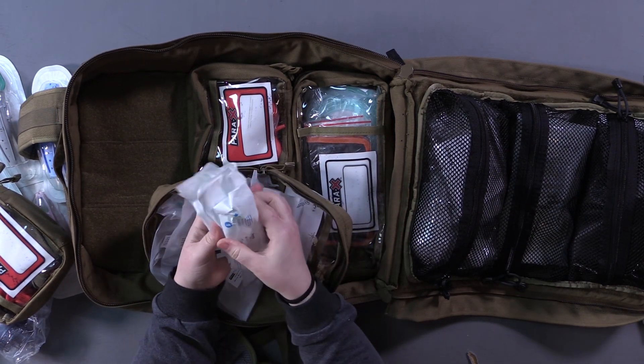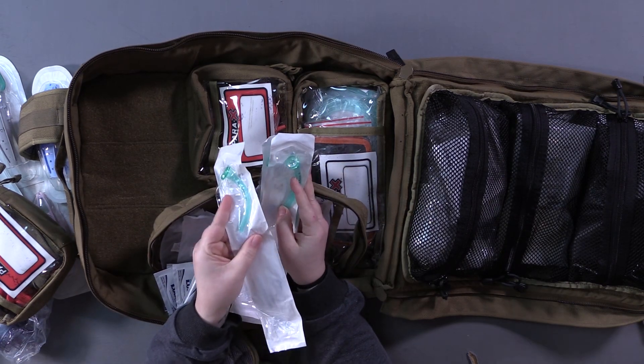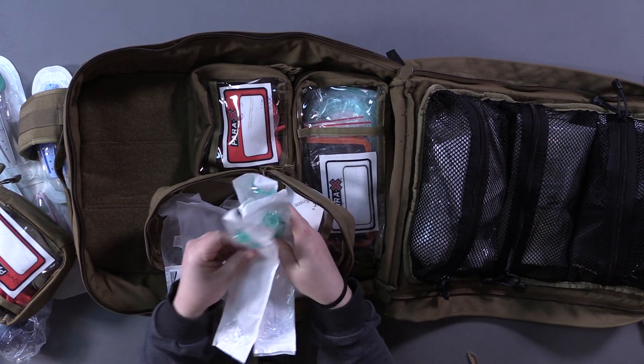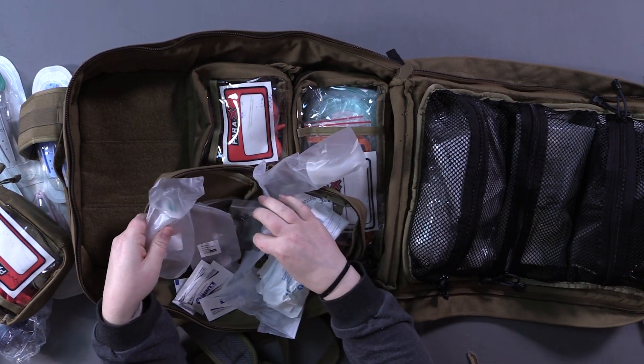This section has airways — a bunch of different sized NPAs with lube, going from preemie and infant all the way up to young teenager. I'd rather you have a bigger NPA than too small, because you can always trim it. For little kids you do need a pediatric size because their nostril is so small it'll squeeze the tube shut and they won't get enough air. We also have a bunch of pediatric OPAs — these hold your tongue forward to protect your airway, with a bunch of different sizes.